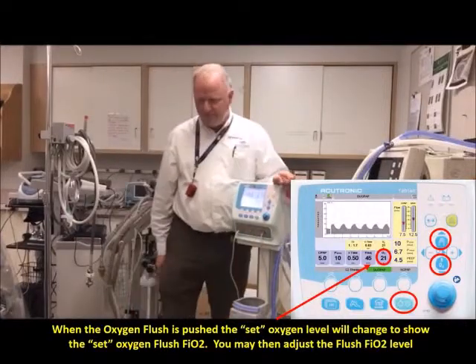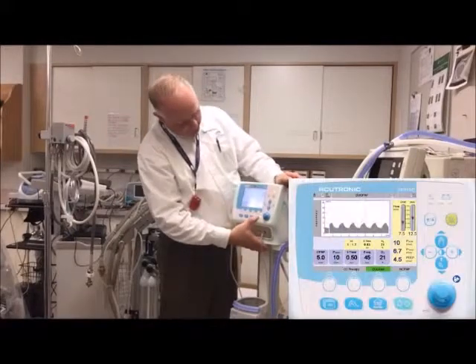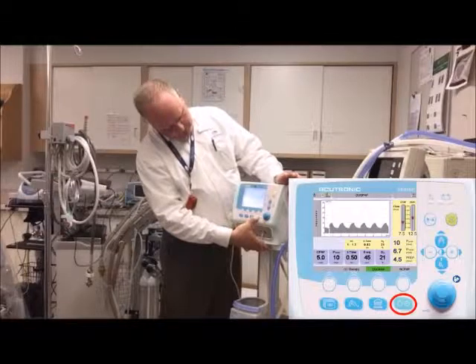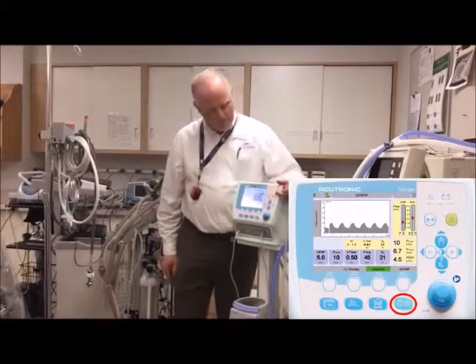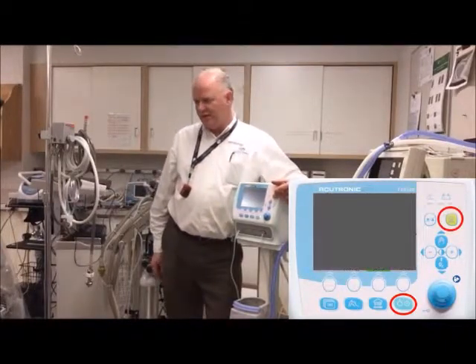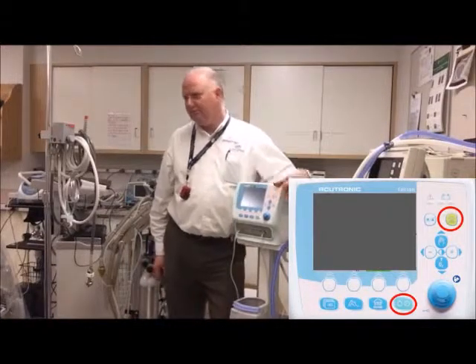To turn it off from standby, you have to turn it back on first and then off. When shutting down, you'll get some alarming — just push the silence button and hold it for three seconds, then let go.